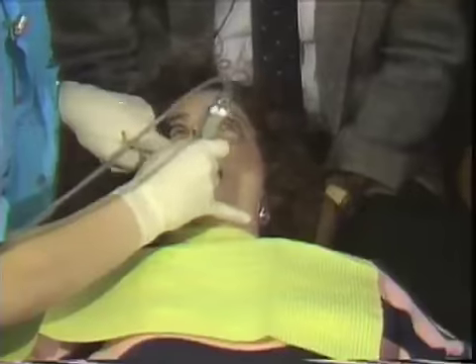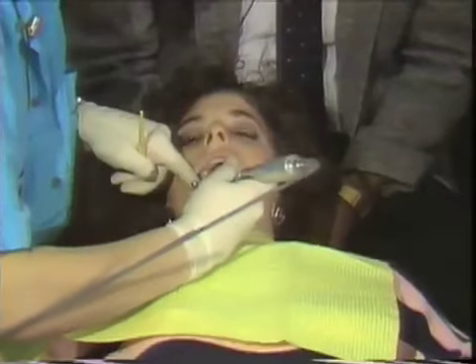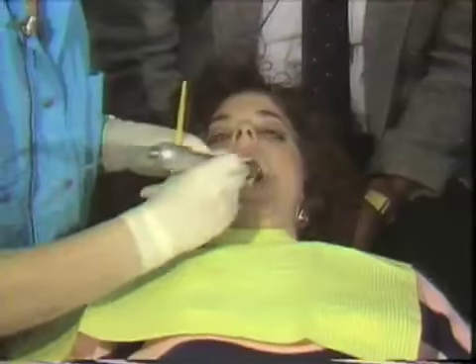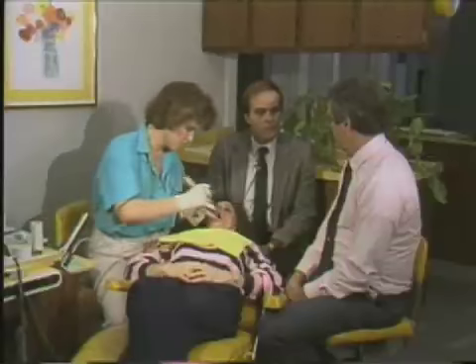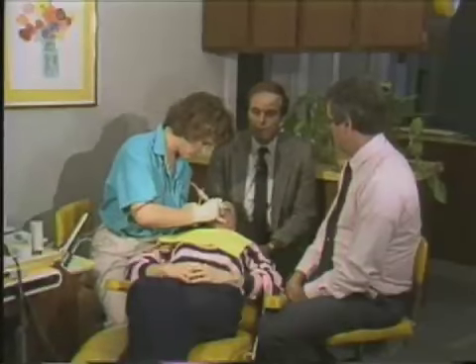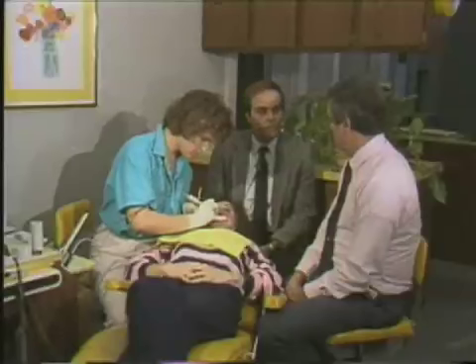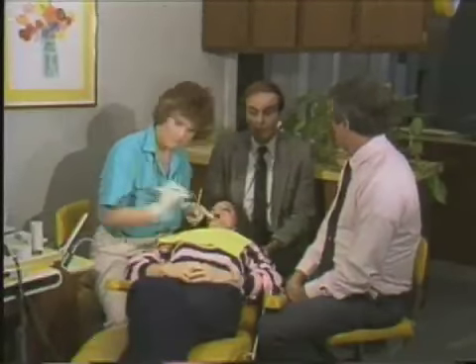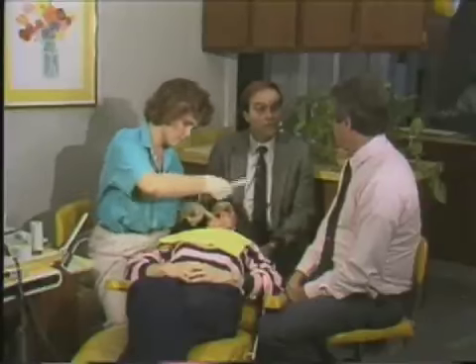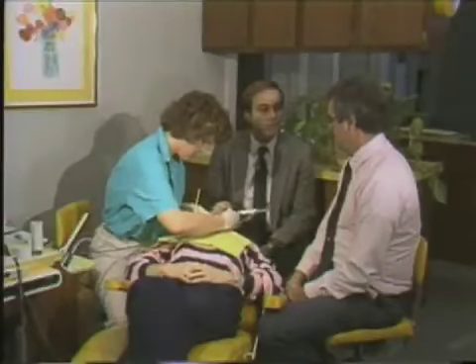Okay. Is there any difficulty if a patient has a fluoride treatment immediately before the bonding procedure? No, there had been the misconception previously that if a fluoride treatment had been given, that it would inhibit the etch process. However, it's been shown that the fluoride used in fluoride treatments or even in prophy paste is totally soluble in phosphoric acid. So if a fluoride treatment is given, it really has no merit at all, and yet it will not inhibit the etch at all either.